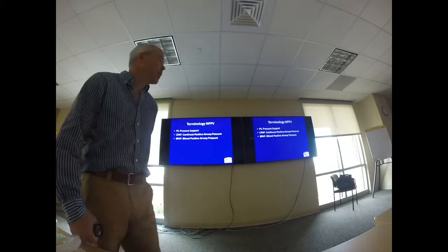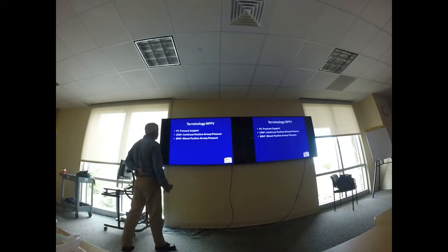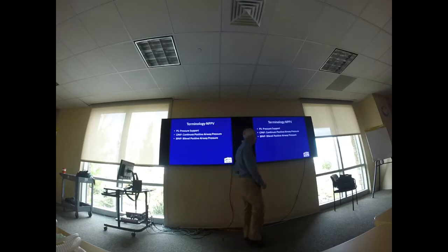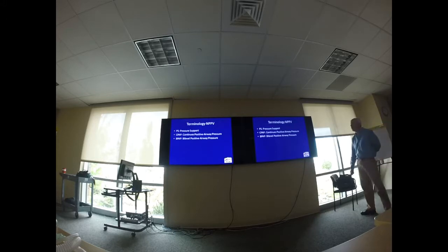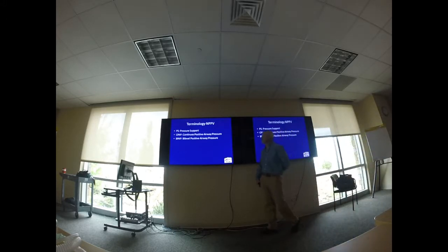What we do with pressure support is we use it to augment synchronized intermittent mechanical ventilation. And usually with a pressure support of above 10 centimeters of water, you're starting to ventilate the patient. You're pushing now. But usually about 10 centimeters will help you combat the adverse effects of all that added dead space.